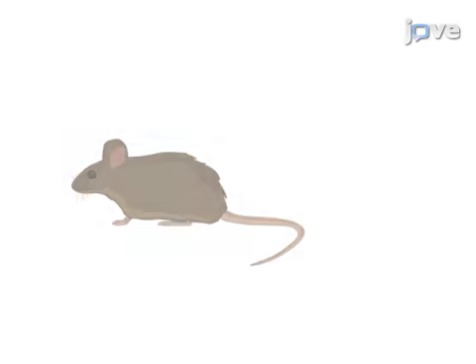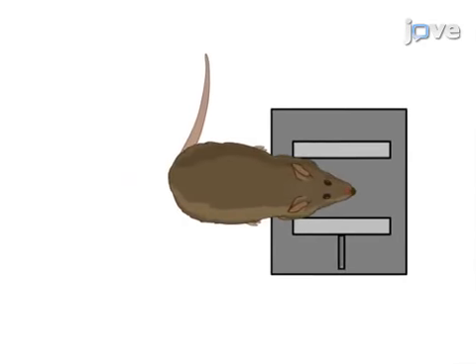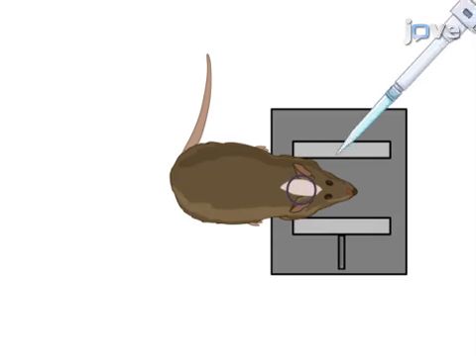The mouse is then placed in a custom metal support, and the scalp, from the back of the parietal bone to the frontal bone, is removed. A rubber ring is then applied directly to the skull with surgical glue, and the reservoir is filled with liquid saline.